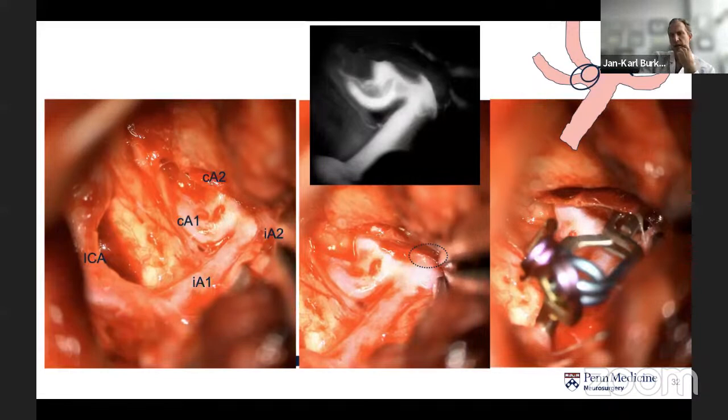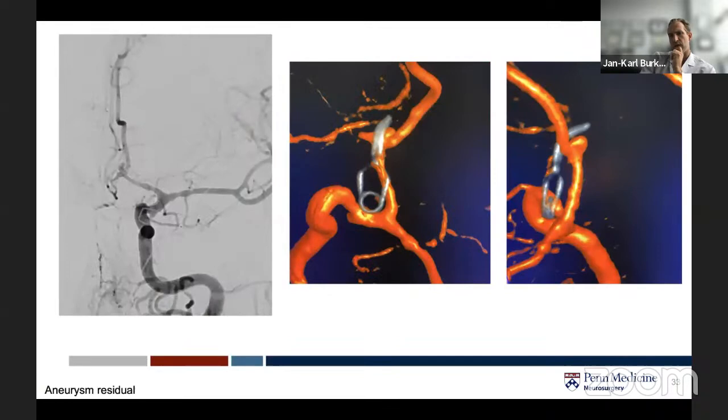And here in the intraoperative angiogram, you can see two things. First, on the 2D on the left side, you can see, first of all, there is spasm. So that's also something the angiogram always highlights, if there's spasm and the flow of the other vessels.